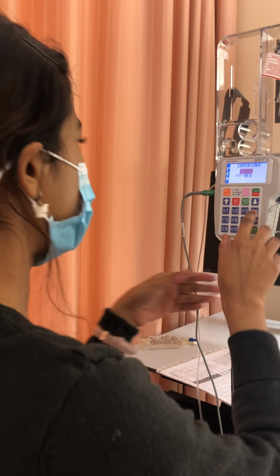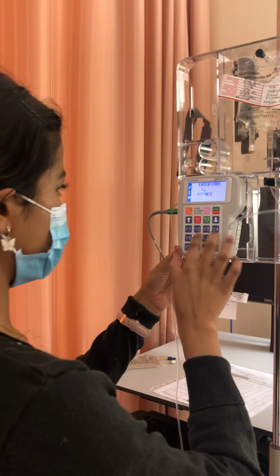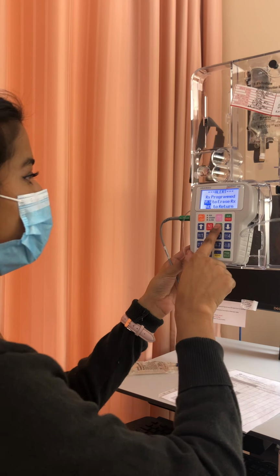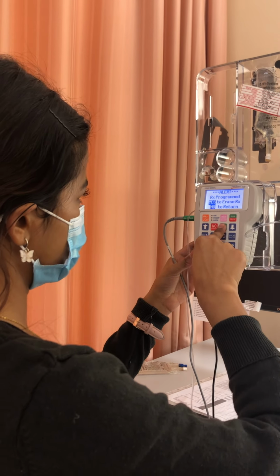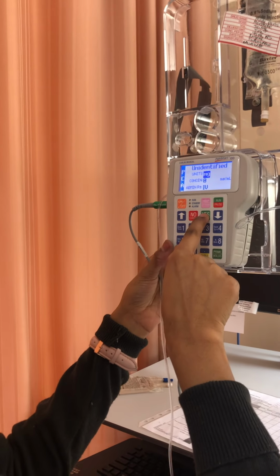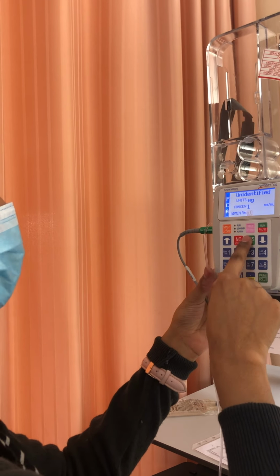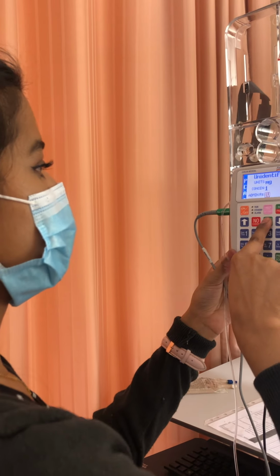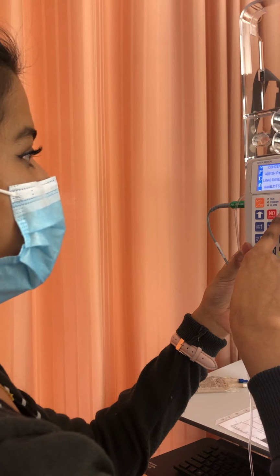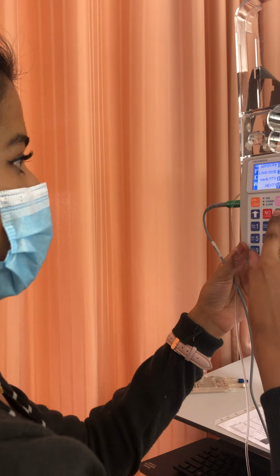So go on that, and then I'm going to use the code. So 94629, 94629, and yes for a new program. Yes. Our units are in milligram, we're okay with that. We have a concentration of 1 milligram per mL, we're okay with that. We have administration rate, IV, so we're using an IV route. I'm okay with that. Loading dose, we don't have a loading dose, so we're going to keep a 0 with that. I'm okay with that. Med limits are off, I'm okay with that. And I'm just going to click yes for next.